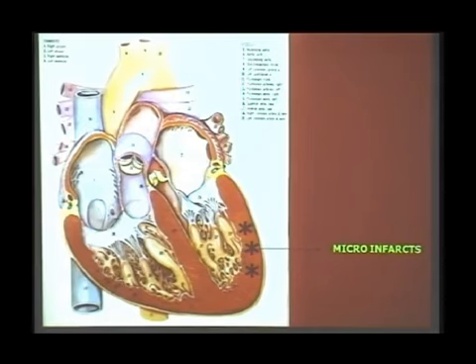So they will come to you with no chest pain. 3 days back they had chest pain. When they come after 3 days, you expect them to be in the acute fully evolved phase. You expect Q wave, ST segment elevation, T wave inversion. But some patients may come to you without any Q wave, no ST segment elevation, only symmetrical T wave inversion. What's happening here is the acute occlusion, before it opened up with our own system, would have produced what is known as microinfarcts. Small microinfarcts, which will be manifested as significant subepicardial ischemia.